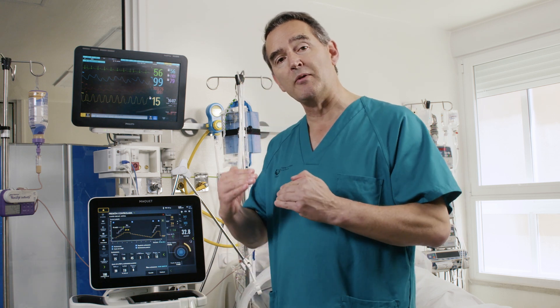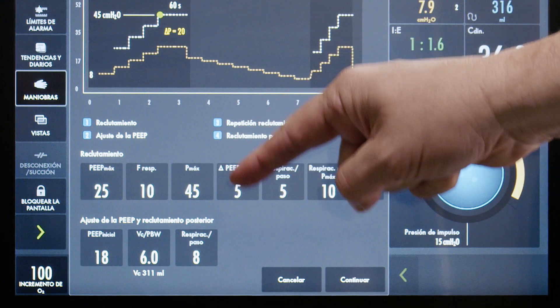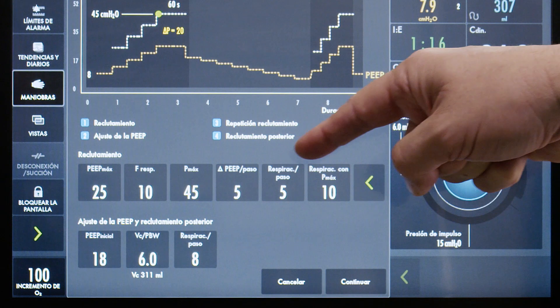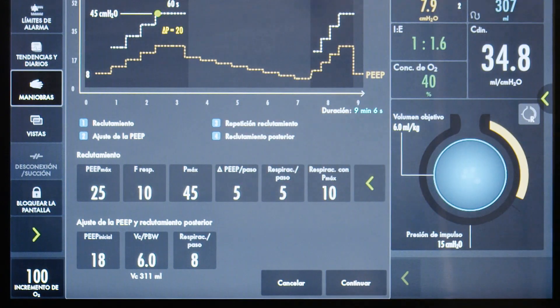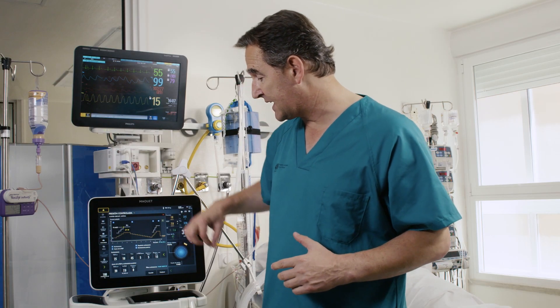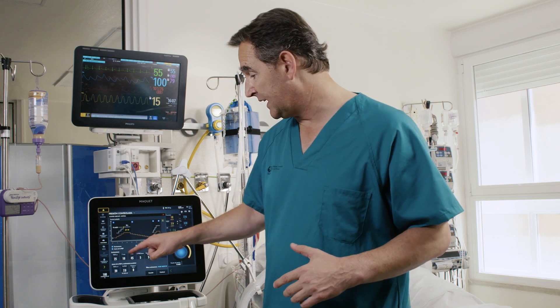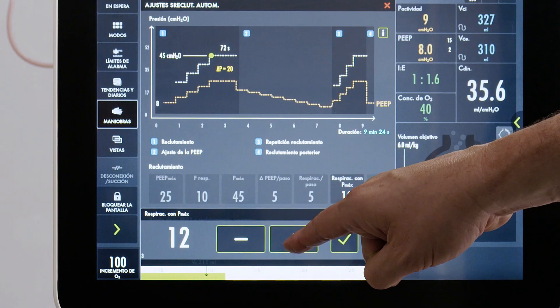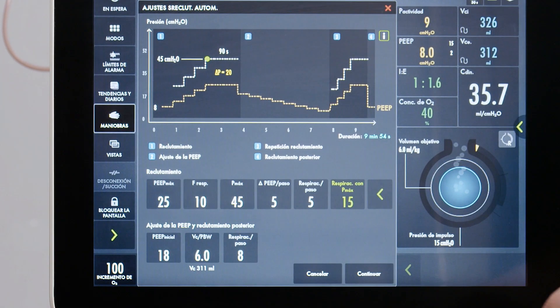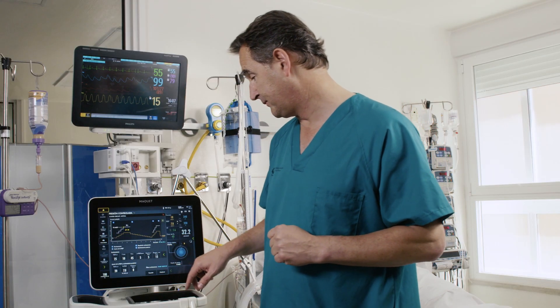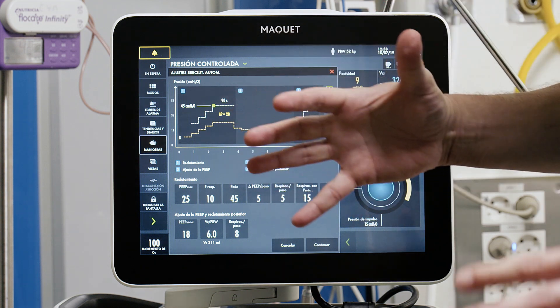Next we select the magnitude of PEEP steps during the first incremental phase — steps of 5 cmH2O, maintained for 5 breaths each, which at this rate means 30 seconds at each level. Finally, we select the time to spend at maximum recruitment pressures: 15 breaths means the recruitment maneuver will last one and a half minutes, which is appropriate for this patient.